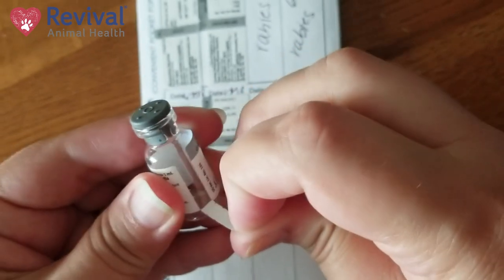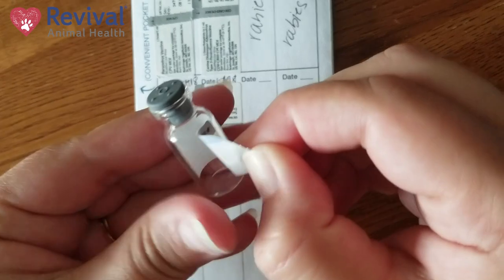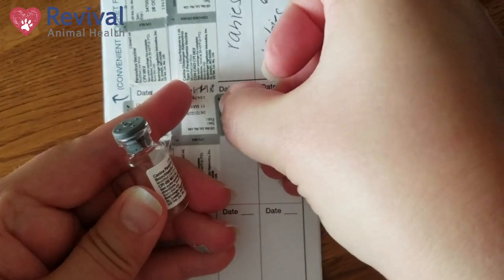When you're all done with your vaccination, take your empty bottles, peel your sticker off your vaccine, place it on your health records, and put the date that you vaccinated. We want that to be a permanent record of when you protected your pet.